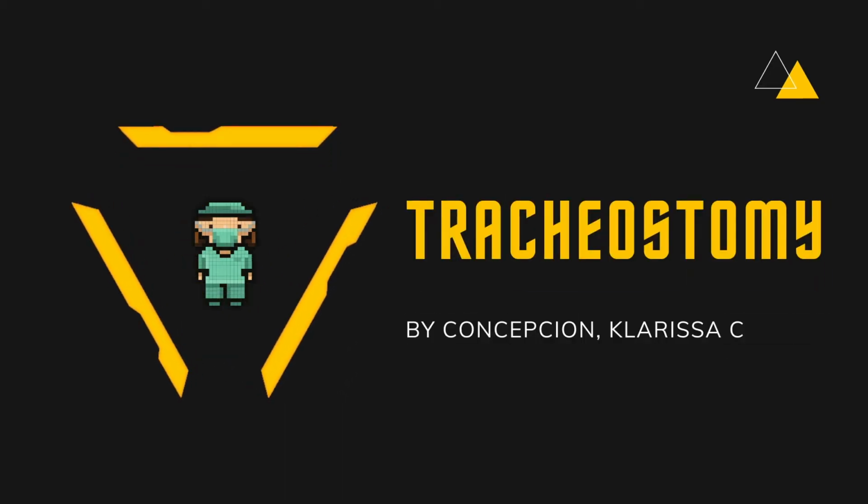Tracheostomy demonstration by senior clerk Concepcion. Tracheostomy refers to the creation of a communication between the trachea and the overlying skin. The opening made will close spontaneously once the tracheostomy tube has been decannulated.